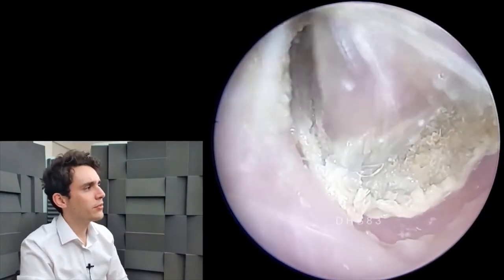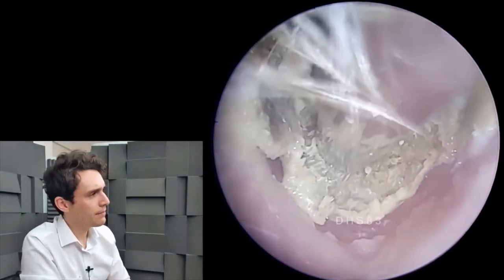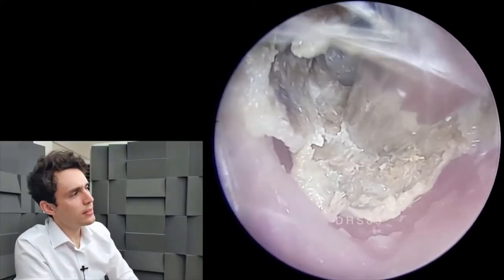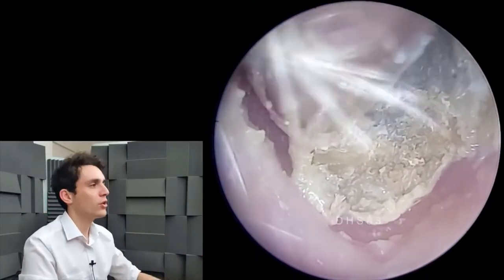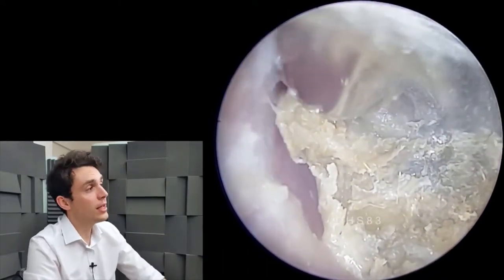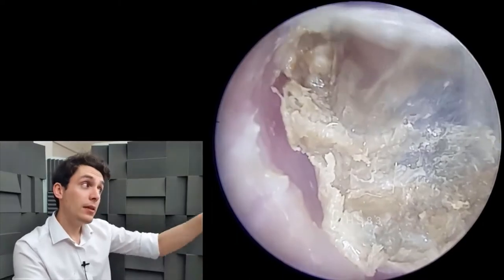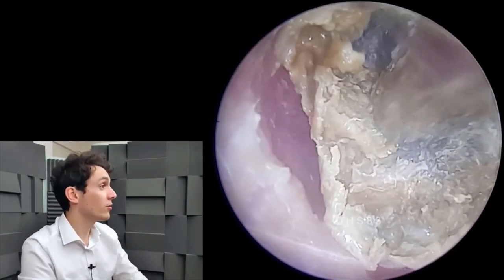I tried olive oil but I don't really get anywhere. We've got a little bit of movement but that's about as far as I get. The problem with this is that normally dead skin plugs like this aren't that much of a problem, as long as it's not full-blown keratosis obturans, and as long as it's been softened to some degree with olive oil or sodium bicarb. In this particular case there's been nothing, so it is as dry and crusty as you can get it.